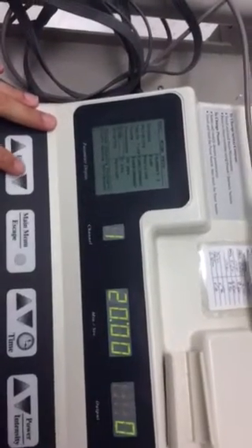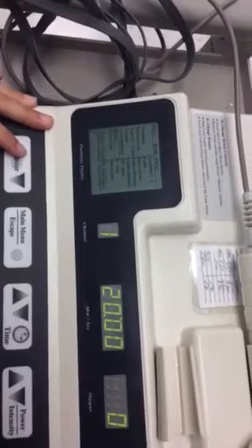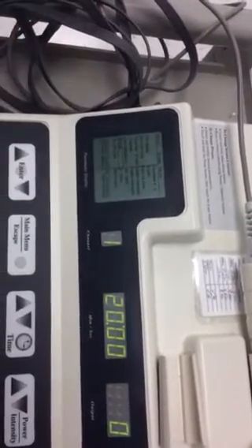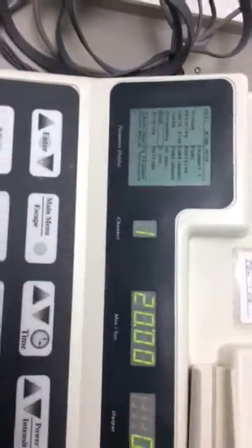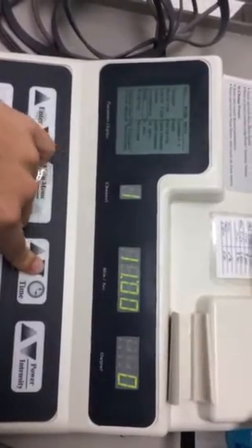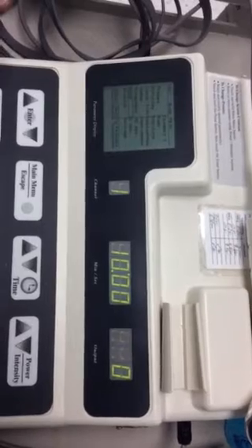Why do we do that? It's more similar to how you contract your muscle. You don't recruit all at once. It kind of phases into the contraction. Treatment time for muscle contraction, you probably want more like 10 minutes or less. So the only thing we change really is frequency.